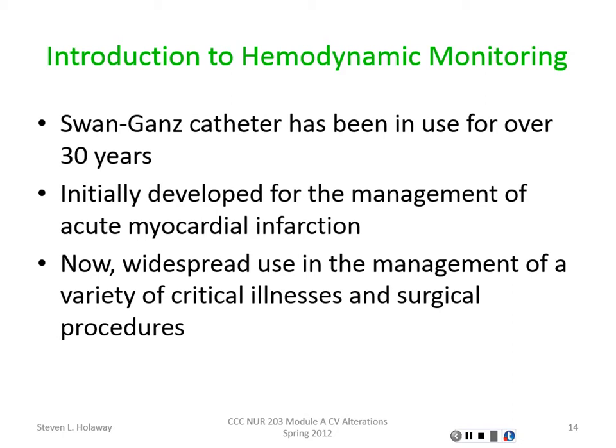So what are some of the reasons we use an arterial line? Blood pressure. In shock patients, we want to make sure we're measuring it carefully. Drugs, okay, when we're using the drugs. And hypertensive crisis. Prevent frequent sticks. Very good. That's why we'll use those.